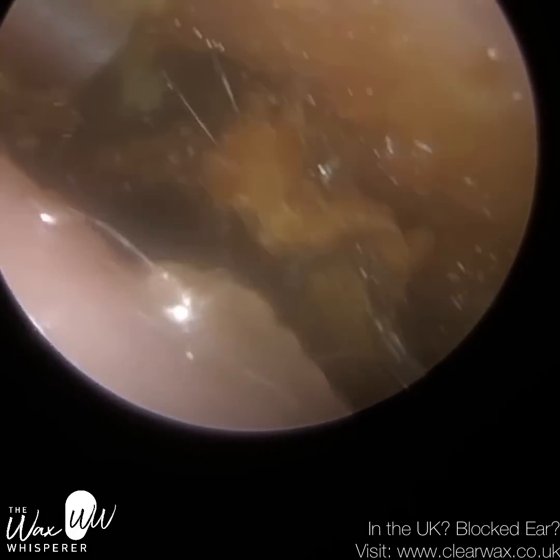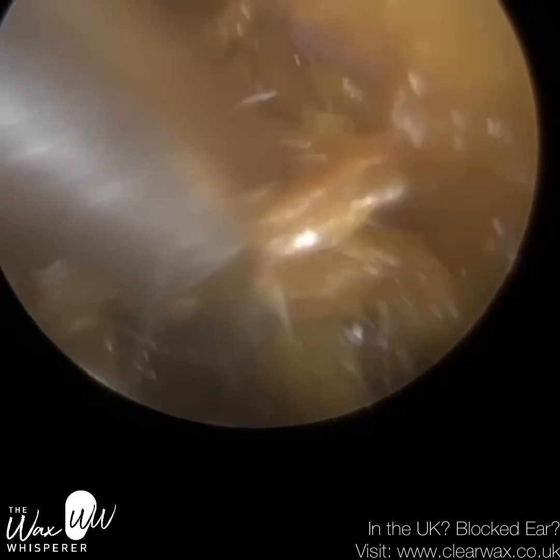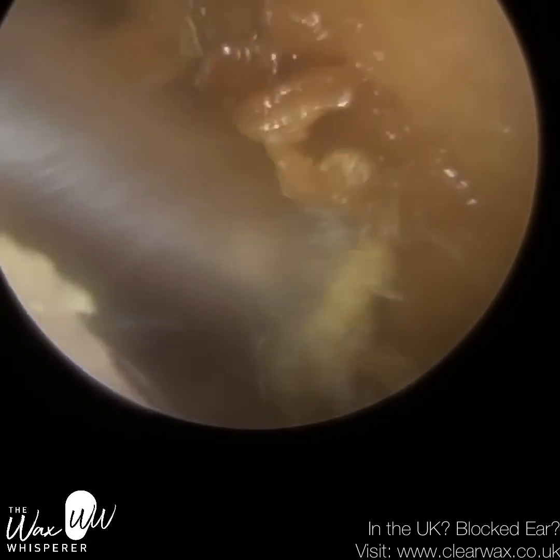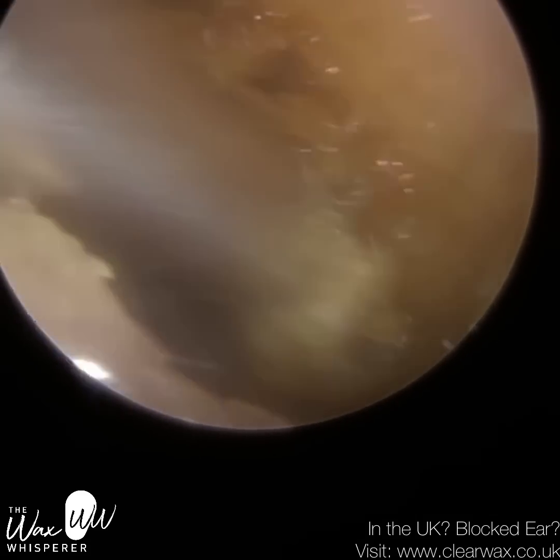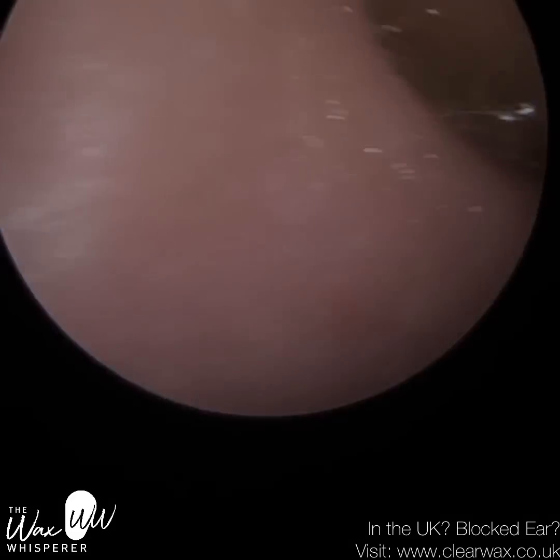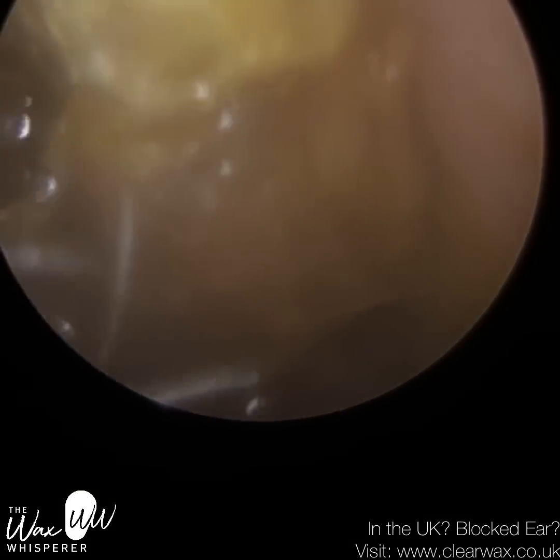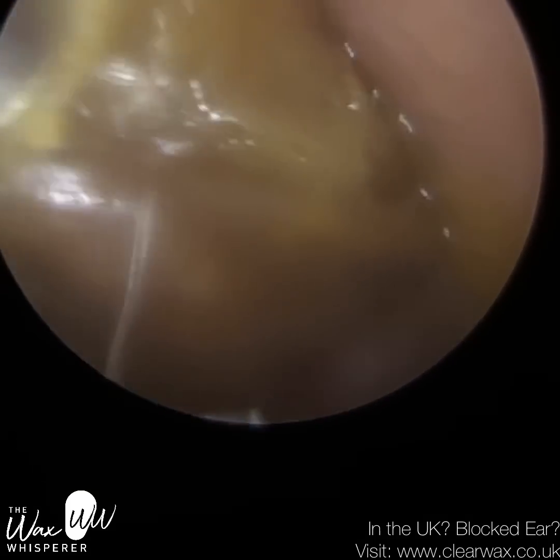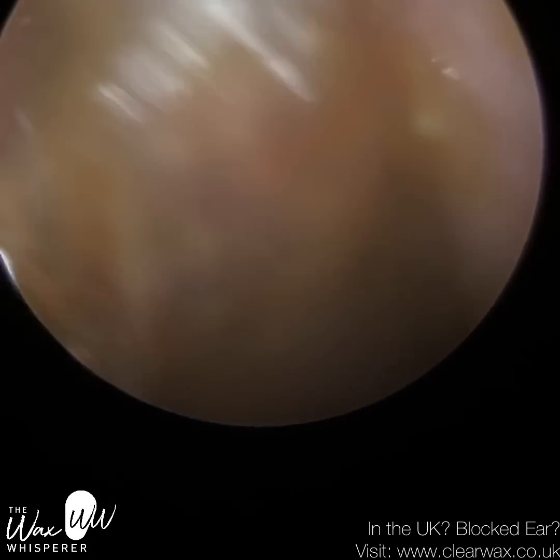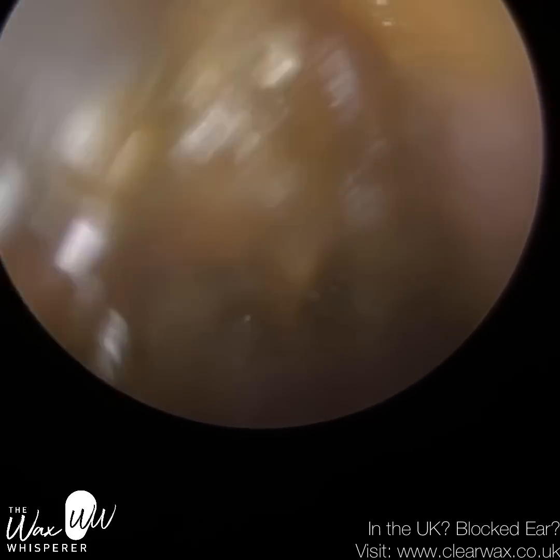When we perform microsuction, it actually reduces the temperature within the ear canal. This patient is sat stationary, their head's still, but because we're performing microsuction in the right ear, the temperature will be decreased, which means the right organ of balance will be sending fewer signals to the brain in comparison to their left ear, because we're not performing microsuction in the left ear simultaneously. So the brain's receiving more signals from the left organ of balance compared to the right, and it fools the brain into thinking your head is moving from right to left.